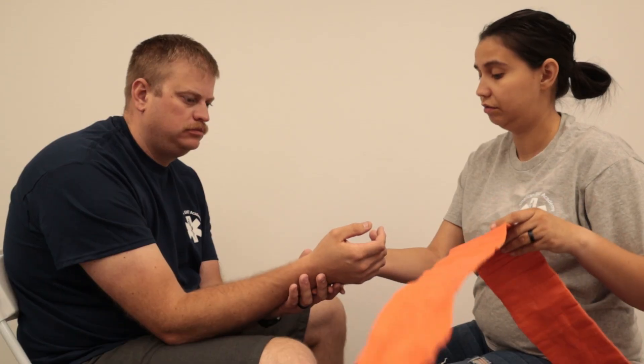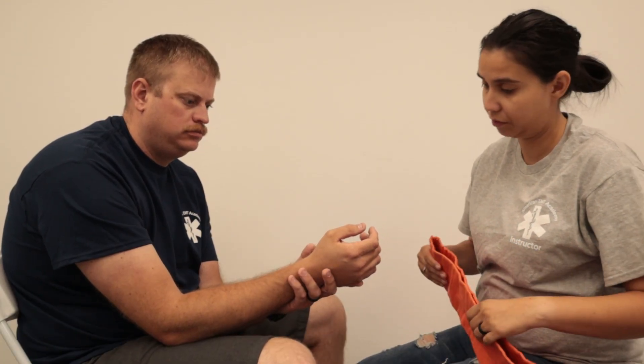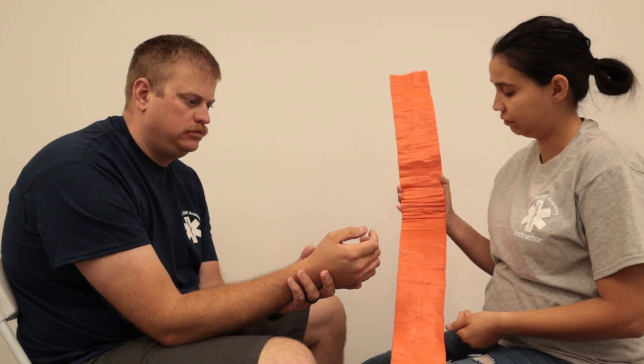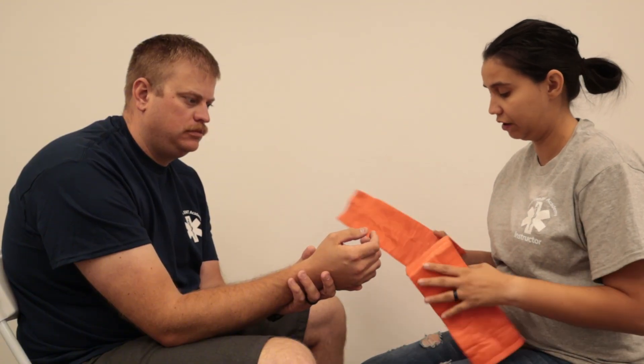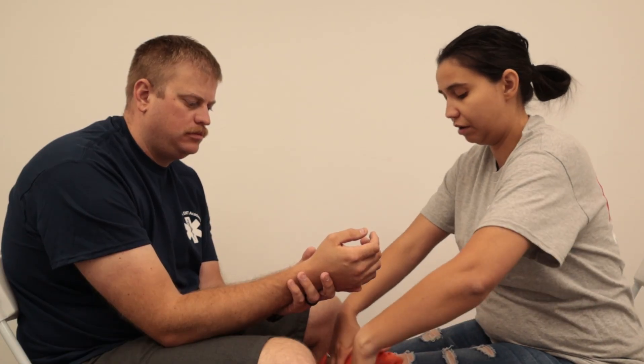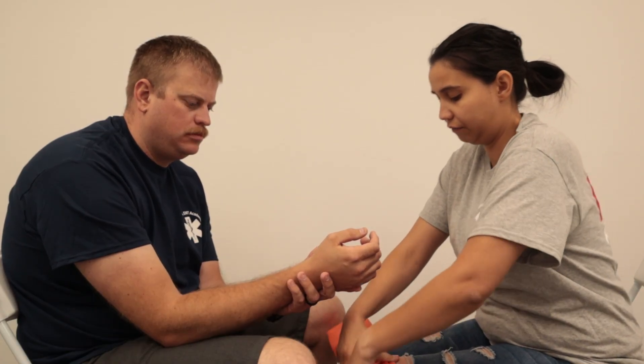Either with the patient or with my partner supporting the injured wrist, I'm going to get the materials I need. There are a couple of different ways you can do this — these SAM splints are foldable, so you can figure out what works best for you. In this case, I'm going to round it a little bit so that it can conform to his arm.